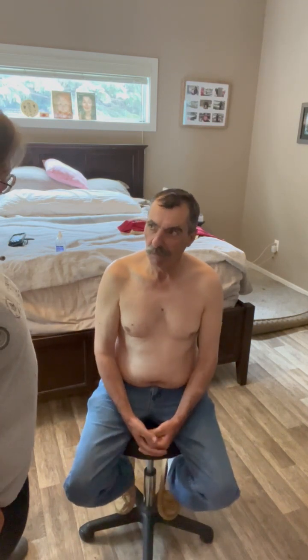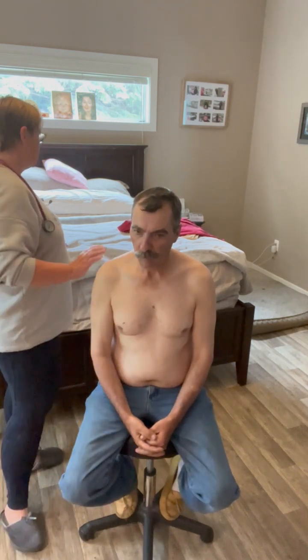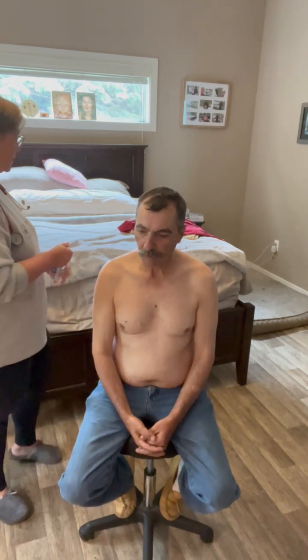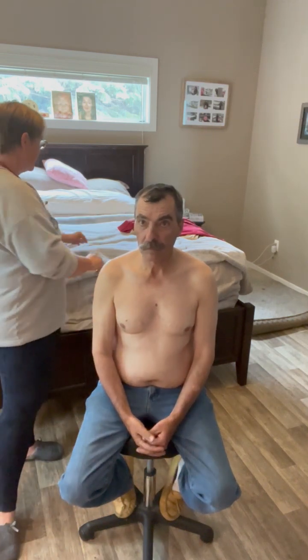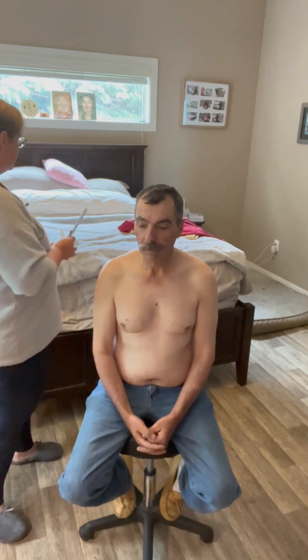Hi there, my name is Joan Cawthorn. I'm a nurse practitioner student and I'll be performing a respiratory assessment on you today. Is that all right? Yes. Okay, good. So the first thing I'm going to do is wash my hands and gather my equipment for this exam. I have my stethoscope, and as well I have a pen and a ruler for one of the tests that I have to do today.